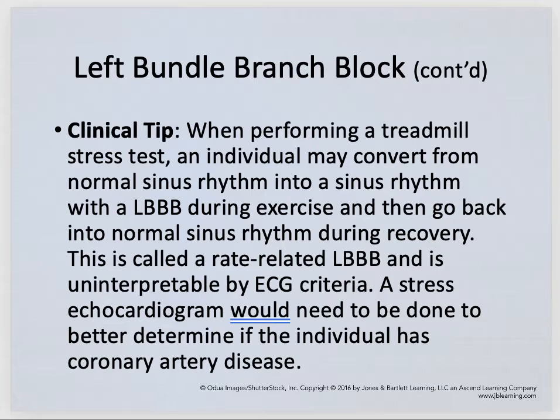What am I saying, guys? At rest, you might see what you would classify as normal sinus rhythm, but we call it exercise-induced left bundle branch block. While exercising, their body needs more blood flow, it's getting a little ischemic, and then they go into a left bundle branch block during exercise, and then after rest, during recovery, they go back to normal sinus rhythm. This is called a rate-related left bundle branch block.